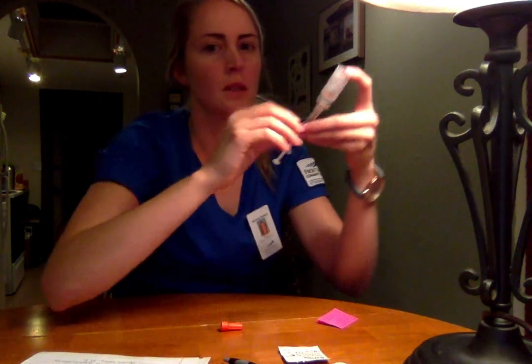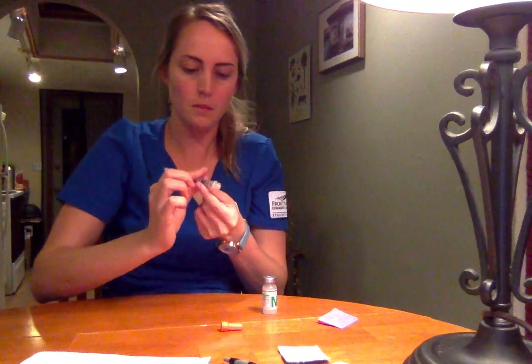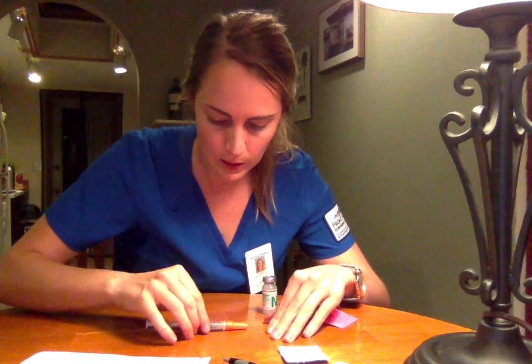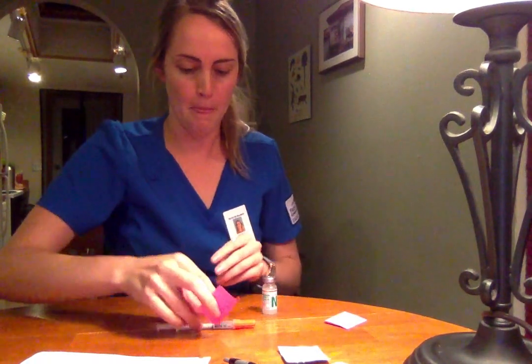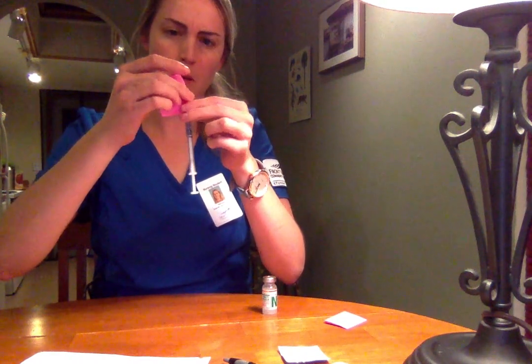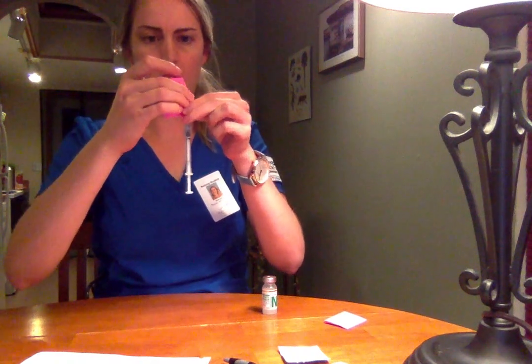Okay, looks good. Now I'm going to recap maintaining sterility using the scoop method. I'm going to put on the label, making sure I'm not covering any marks on the syringe. I'm putting it up here, and I'm just going to have it like a flag.